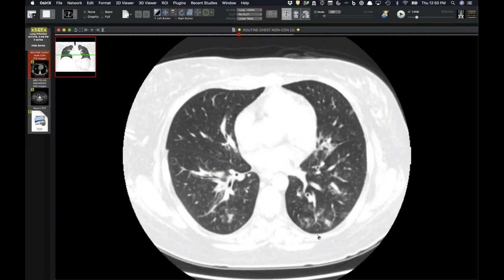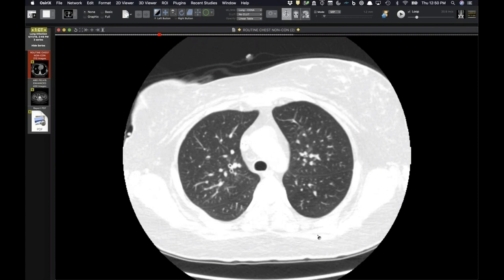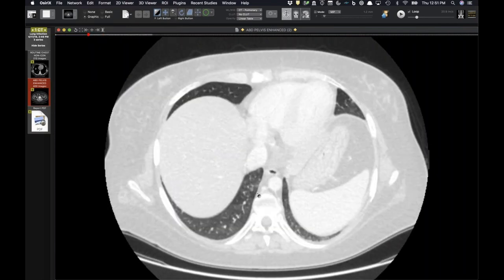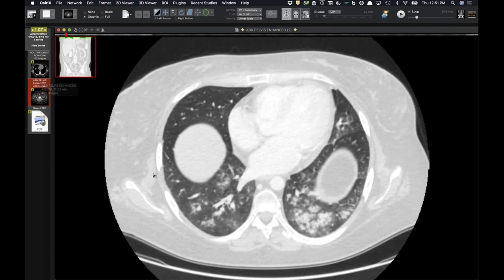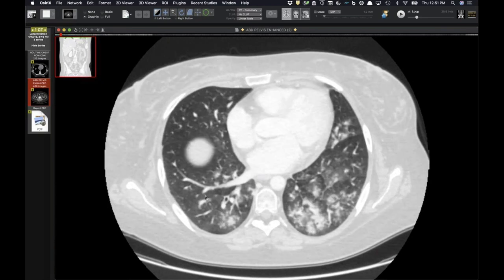But we've had some cases of viral infections that have serial CTs on them, and they usually start out most pronounced in the upper lungs, but with time you get more and more basal consolidation, and as in your case here, the most pronounced consolidation is in the left lower lobe. Yeah. But I do think that what's happening is that there is an aspiration component that is filling the lower lobes, and it often goes selectively to the left, and that is from secretions in the upper airways draining down and pooling down there.